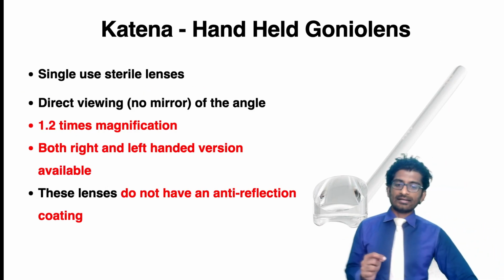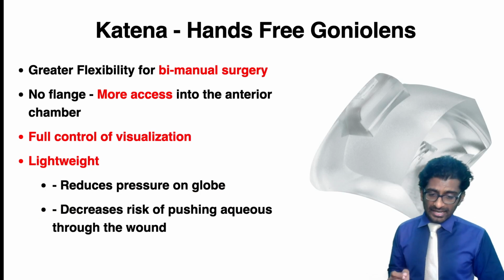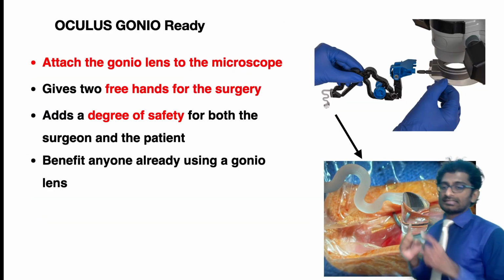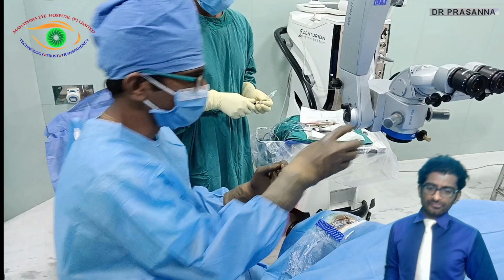There is a Katena handheld gonio lens. It does not have the anti-reflection coating. We have the Katena hands-free, and then the Ocular Secure Flex hands-free surgical gonio, and the recent one attached to the microscope, Oculus Gonio Ready. So there are n number of gonio lenses.